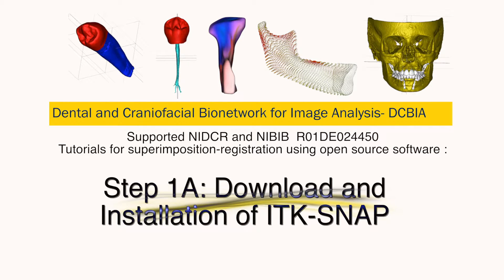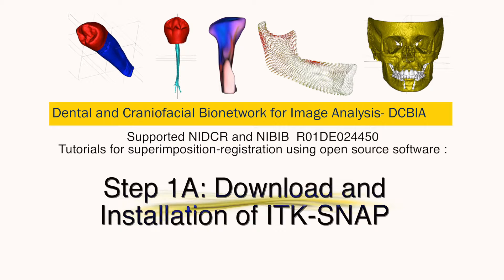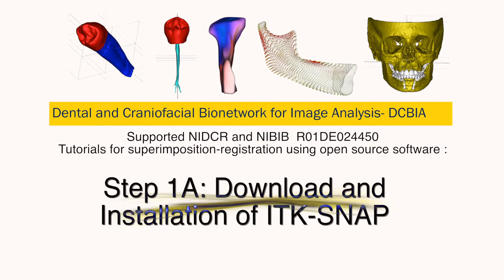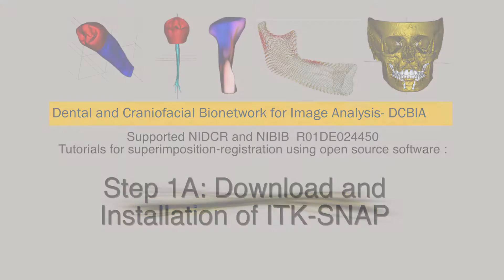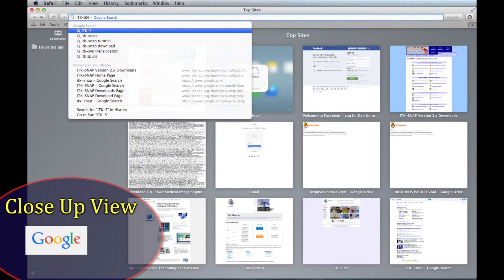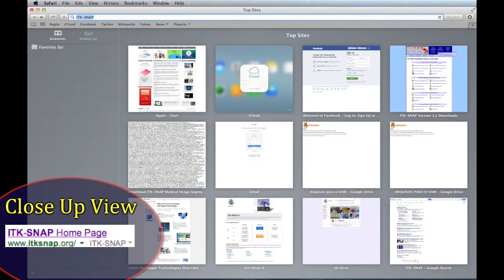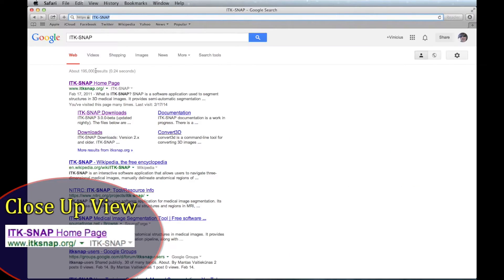This tutorial will go over how to download and install ITK-SNAP. First, Google ITK-SNAP or go directly to the website.